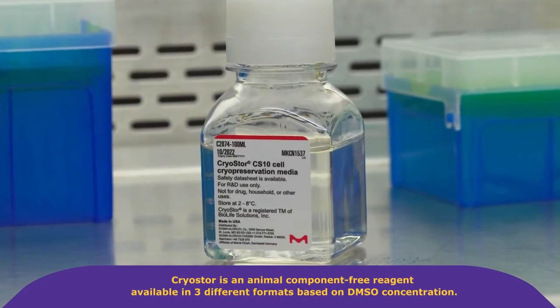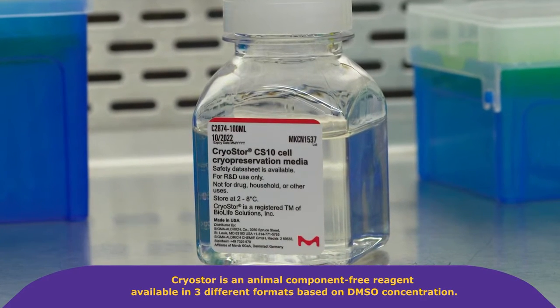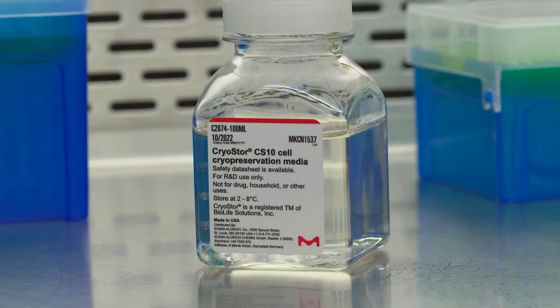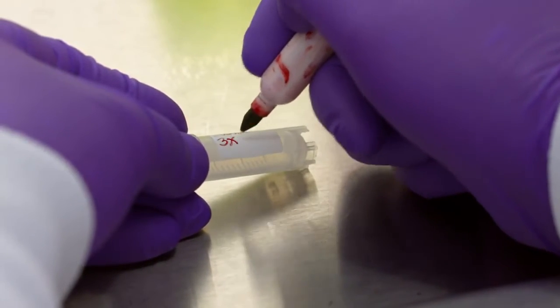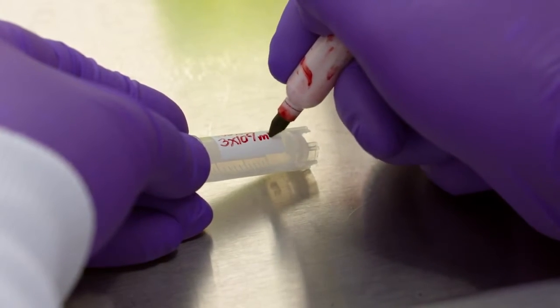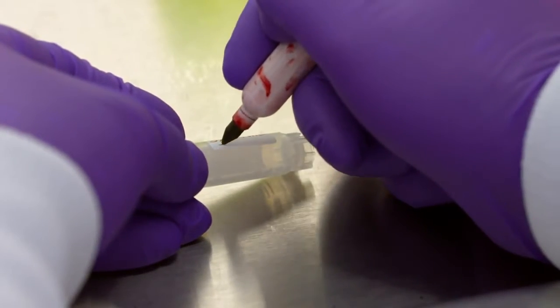CryoStor is an animal component free reagent available in three different formats based on DMSO concentration. Freezing media should be chilled prior to use. To minimize cell exposure to DMSO at room temperature, it is a good idea to label the cryo storage tube before starting. Include the cell type, passage number, date of freeze, and cell concentration.